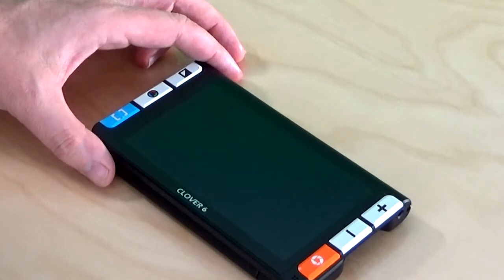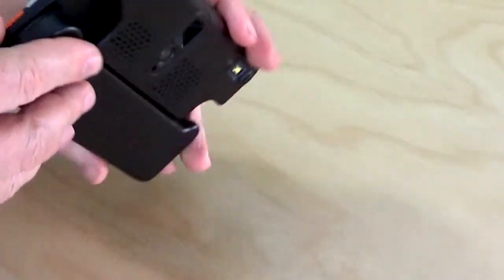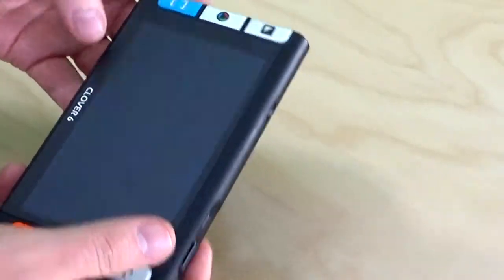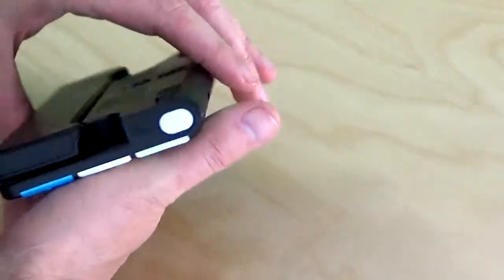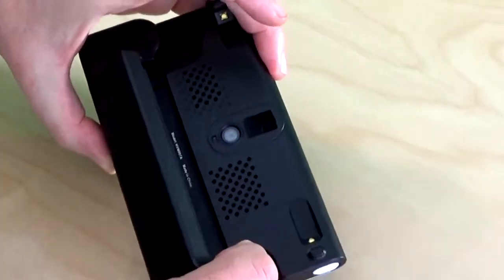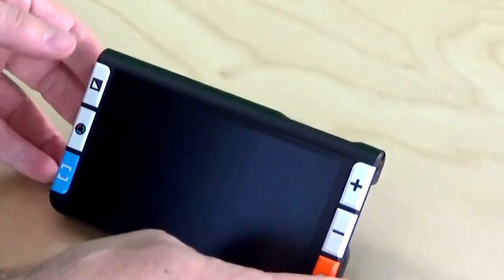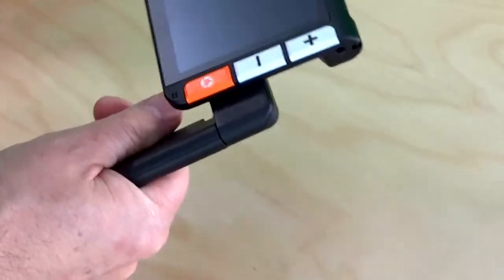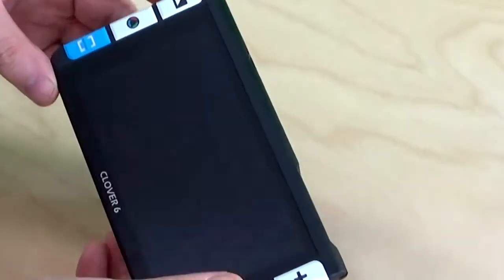Let's take a closer look at the Clover 6 video magnifier. First of all, we have a nice flat, thin design here — it's real light and easy to carry. We have a couple different ways to use it: there's a stand in the back that will flip down so you can set it in a reading position, and you also can take the handle out and use it like a magnifying glass.